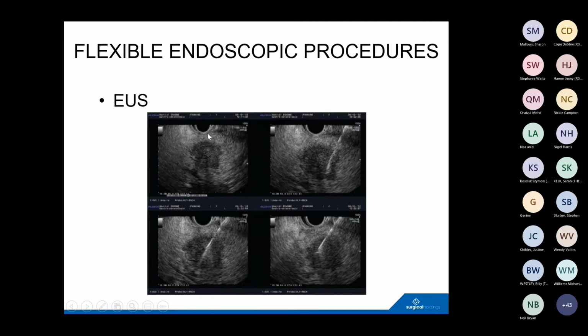This is the endoscopic ultrasound, the endosonography image. That's the area of interest. You can see this white line is the needle going into that area of interest a number of different times. So the needle technology has come on a lot, so it really does show up better, it reflects the sound better for better visualization of the needle tip. You take out the cells in the area of interest and obviously send them on to pathology.